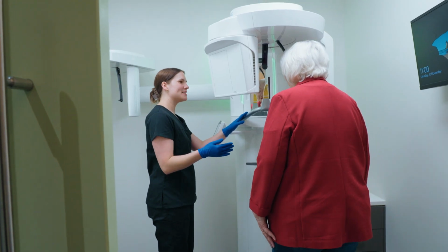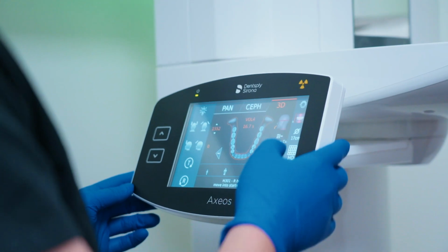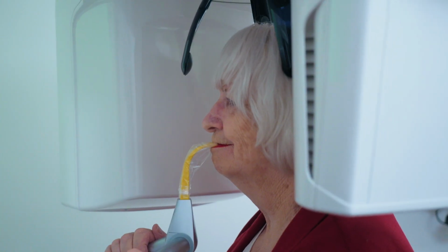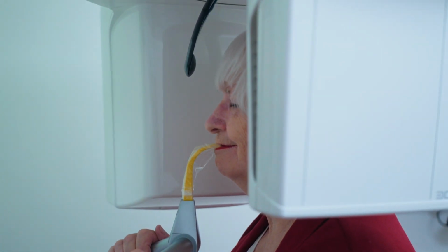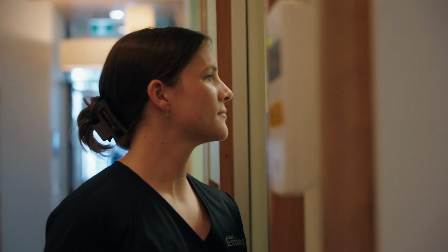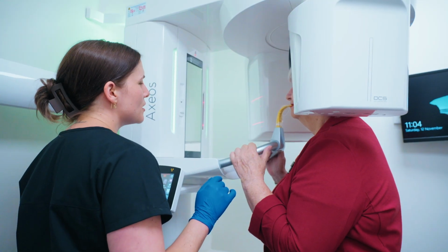We've also got a cone beam CT machine. It's really a 3D X-ray technology unit that allows us to get amazing amounts of detail about your dental problems. There's nothing that hides on these X-rays. We can preempt a lot of painful and expensive dental problems.